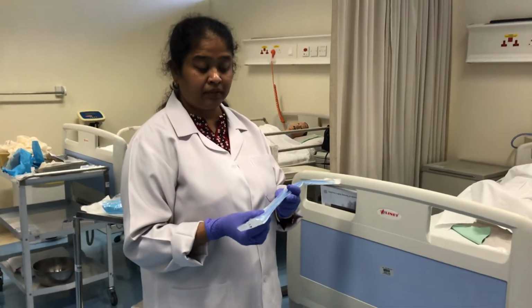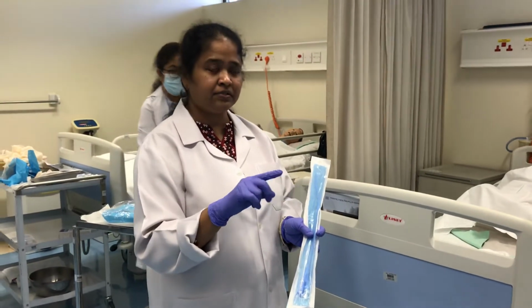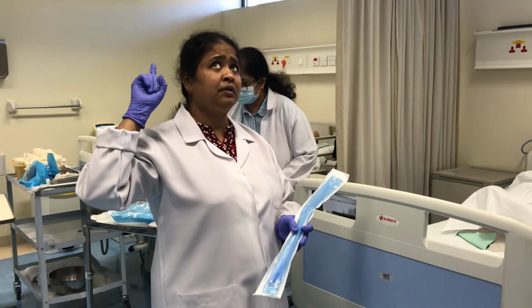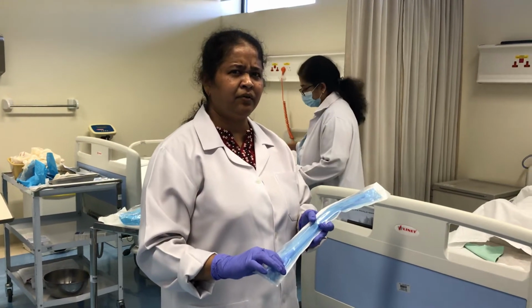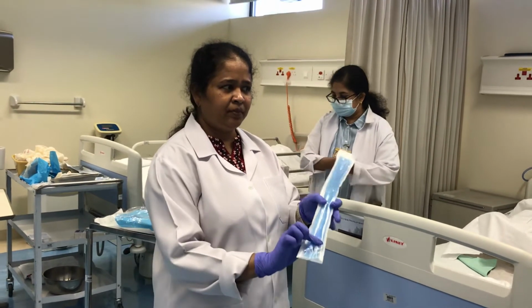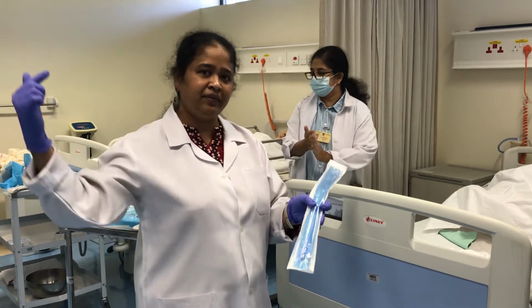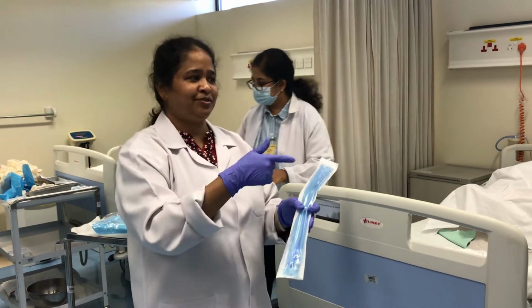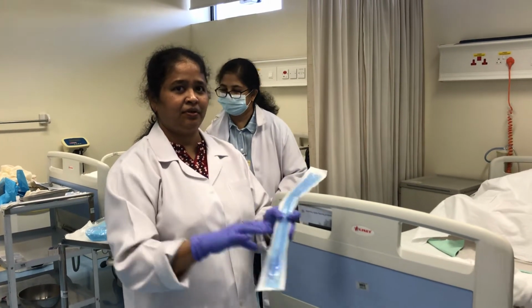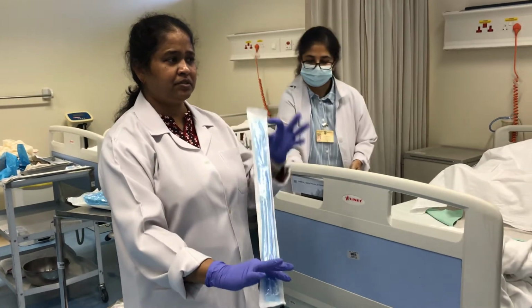And this is a 2 lumen catheter. We have a 3 lumen catheter also. That is for bladder drainage. You will find it in the hospital setting, bladder irrigation for male patients when they are undergoing BPH, TURP, prostate surgeries. They will be put on that catheter, because one lumen is for drainage, and through the other lumen they will be given very large amounts of IV fluids. So it washes the bladder and brings out the blood and urine and the tissues, all that. So you will find different catheters when you go to hospital. This is the common one which we use. This is for long-term use.